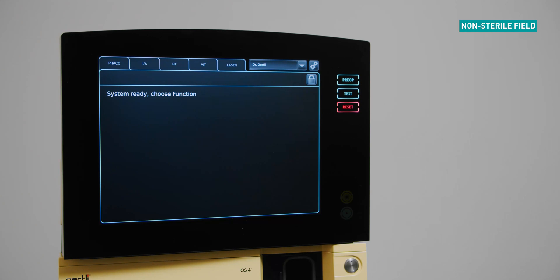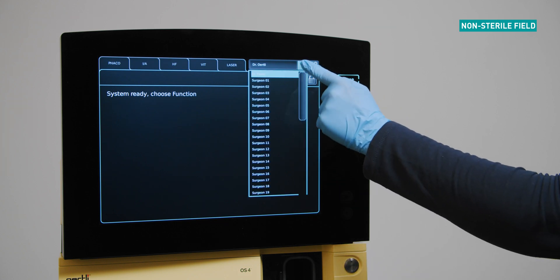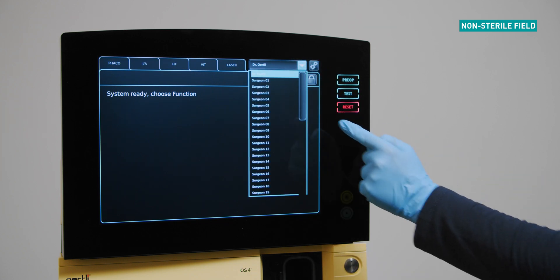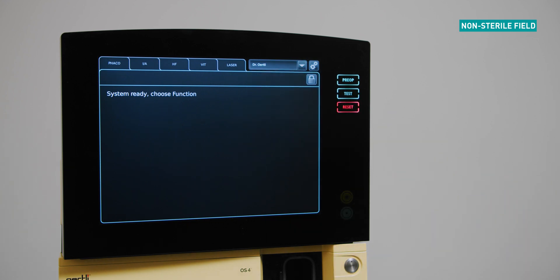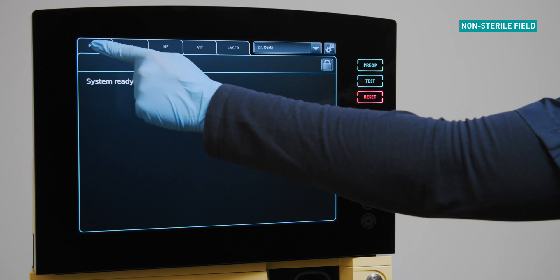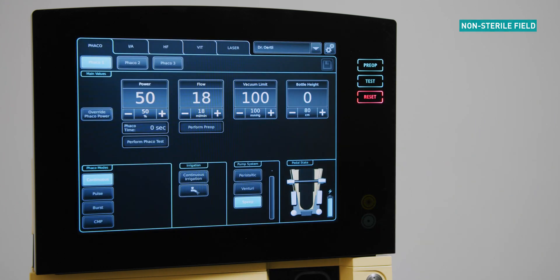Select a surgeon as follows: ensure the pedal is in the zero position, tap on the arrow in the surgeon memory field as indicated, select the desired surgeon from the memory. Select FACO function from the menu tab.